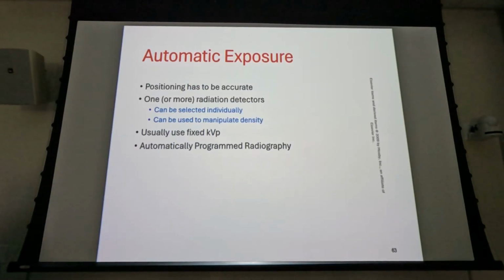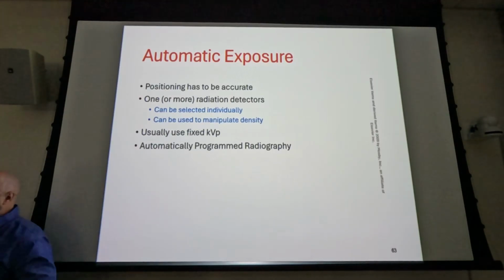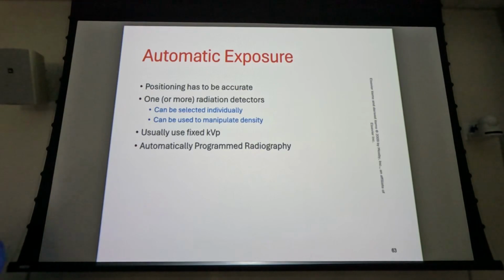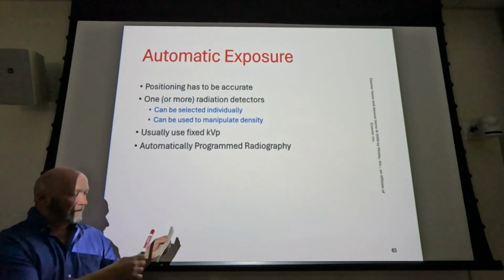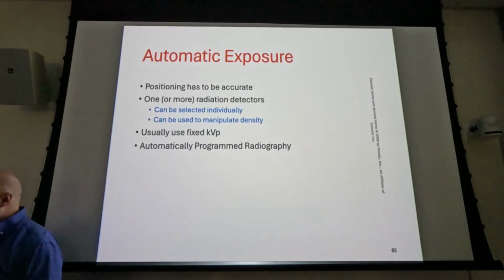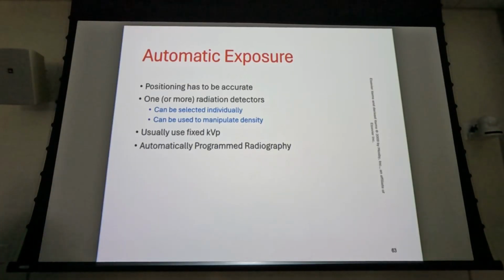If you're setting manual techniques, you've got some latitude in your positioning. You can off center, and this is not an issue at that point, because you set your technique and you're not dependent on your automatic exposures. So you can use different orientations of radiation detectors.